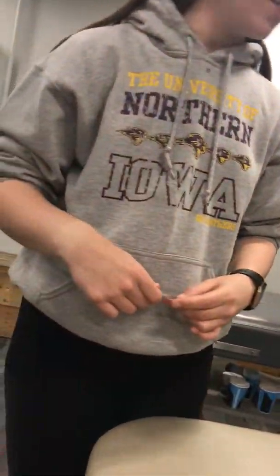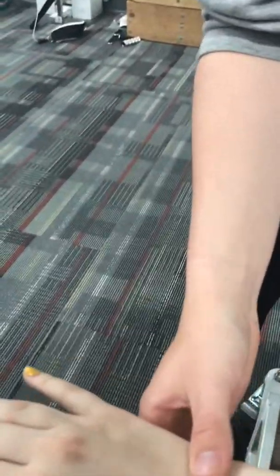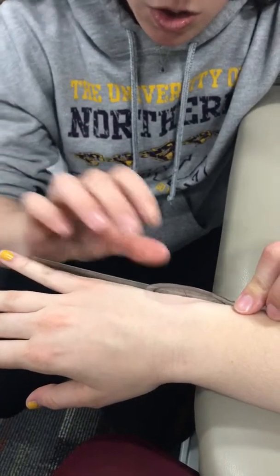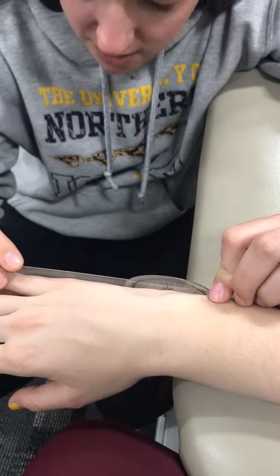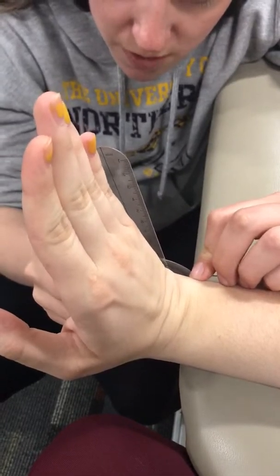Starting with active range of motion wrist extension. Have the patient seated with their arm at their side and hand off the end of the examining table. Have them demonstrate the motion, then place the fulcrum over the ulnar side of the joint line, the stationary arm along the midline of the forearm, and the motion arm over the midline of the fifth finger. Normal range of motion is 75 to 85 degrees; she's at 84, which is within normal.